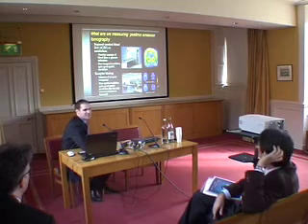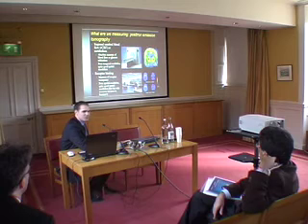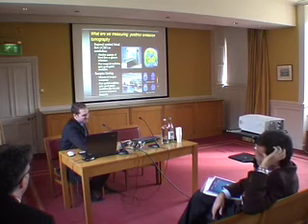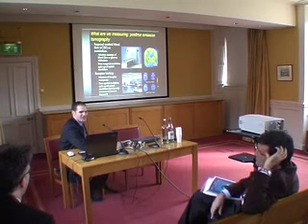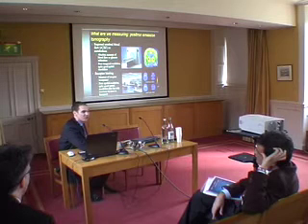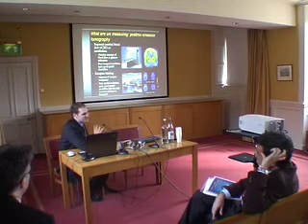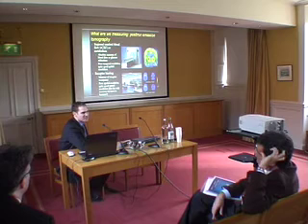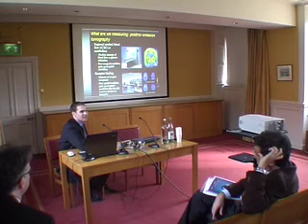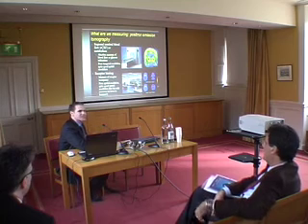So let's talk first about the things that people don't use so much anymore, but at least we knew what we were really measuring. That sounds like a slightly pessimistic statement, but unfortunately in modern brain imaging experiments, for those who use functional MRI, what we're really measuring doesn't have any units. So the thing I like about the old positron emission tomography studies, which of course are still carried out, but fMRI has superseded them a little bit, is that we actually get units for the things that we're measuring.